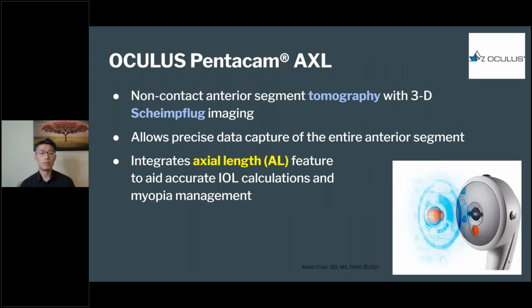Let's dive into a little about how we can use the OCULUS Pentacam AXL to help your patients and serve their needs.